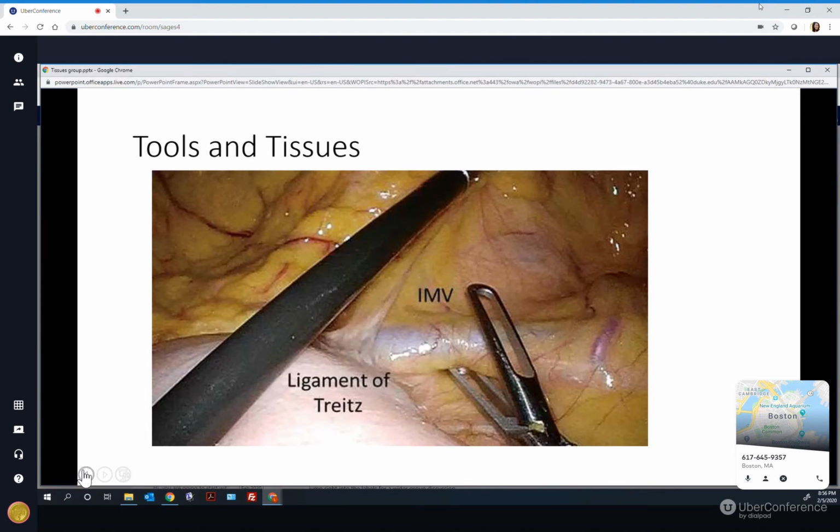If I did not have the context that this is a left colectomy, let's say I am a first-year resident, I just walk into the operating room, I see the belly open, you show me this. I don't know what you're doing. My first year, yeah, so then I would say that it looks a little bluish, so that must be a vein. There's a lot of fat. And I know I'm in the belly, so somewhere around me is the peritoneum.